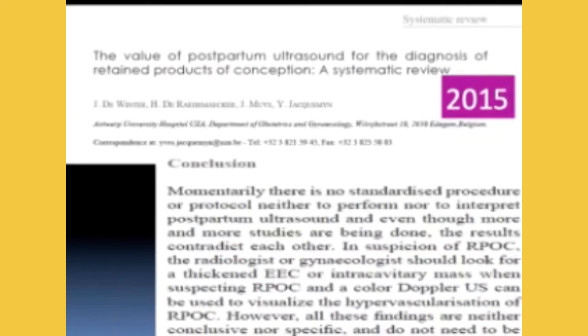Again, in this paper published in 2015, they dealt with the value of postpartum ultrasound for the diagnosis of retained product of conception. Here also, they found that the thickened endometrial echo complex and the intracavitary mass are suspicious of RPOC, and color Doppler ultrasound can be used to visualize the hypervascularization of RPOC. But at the same time, they concluded that all these findings are neither conclusive nor specific and do not need to be present in every case of RPOC.